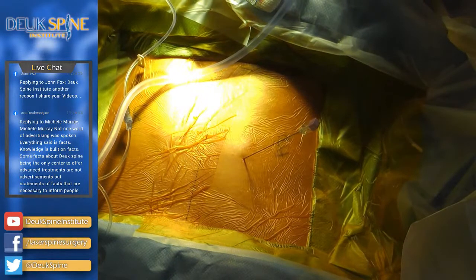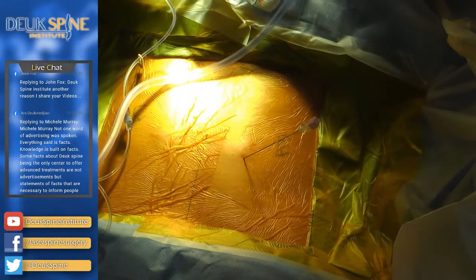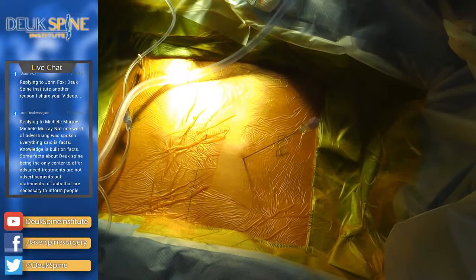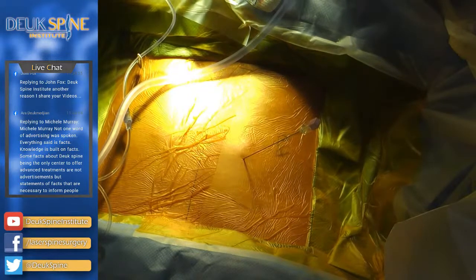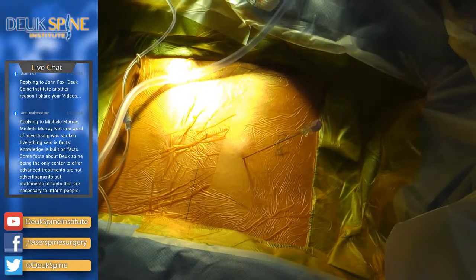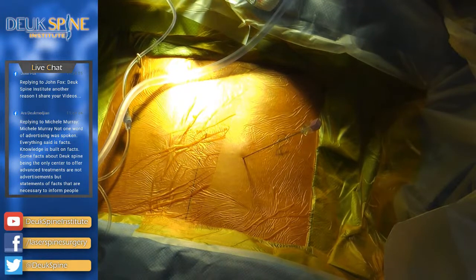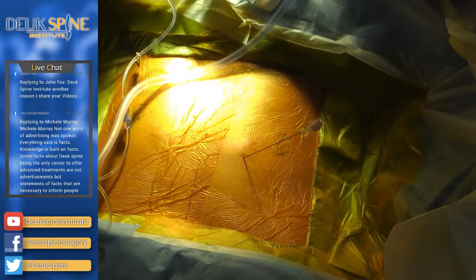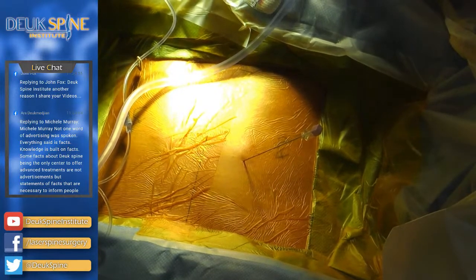And shot. Okay. Now, let's see. 12, 11, shot. And the table, sorry, the fluoro, where is the fluoro? All the way down? Yes, sir. All right, we can probably drop the table just a half an inch. Just a half an inch is fine. That's good. Right there, that's fine.